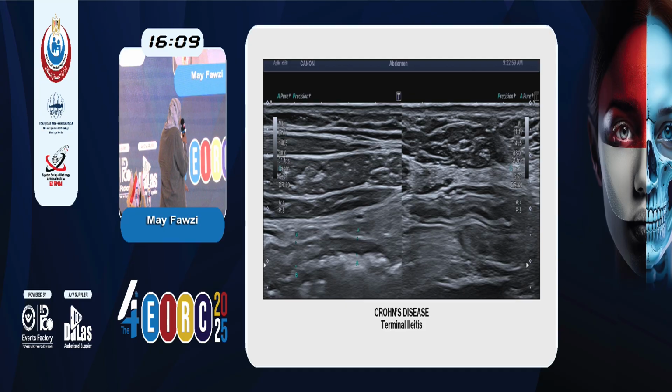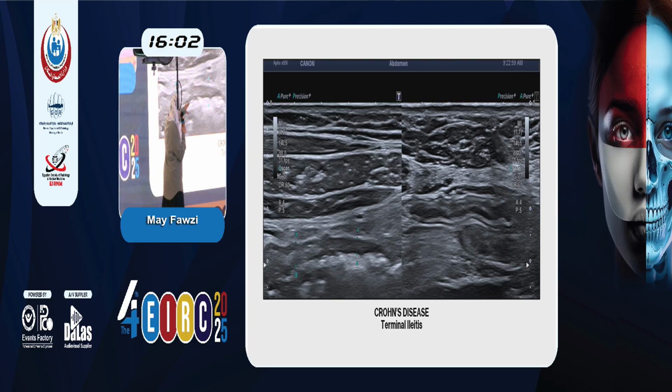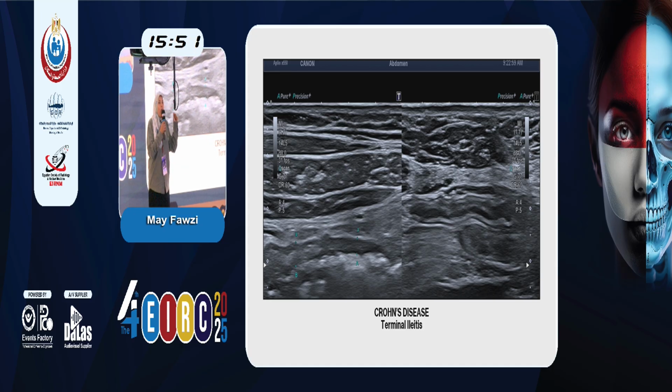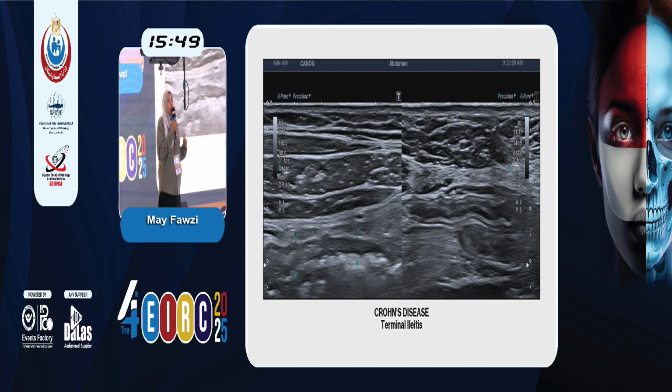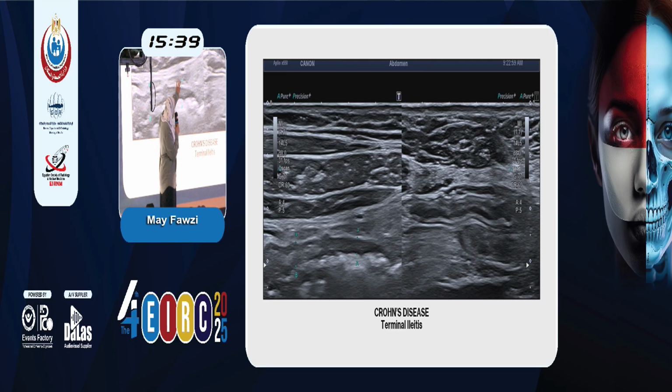As you can see, I have measured an abnormal bowel wall that does not show the 5 layers. Where are my 5 layers? I have a white layer here, which I'm not going to include, and a white layer there, that is the serosa, which I did not include. And in between, I cannot properly see the white layer in the middle. No submucosa, because inflammation leads to edema. Edema leads to hypoechogenicity. And as I can see here, this is a hypoechoic bowel wall.